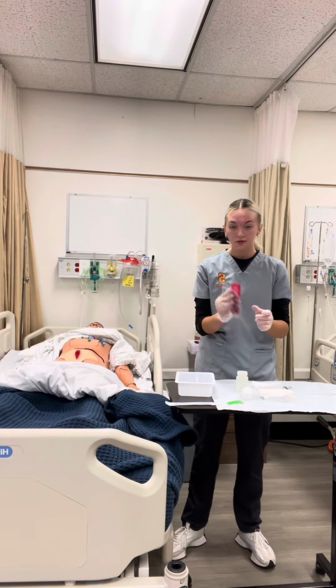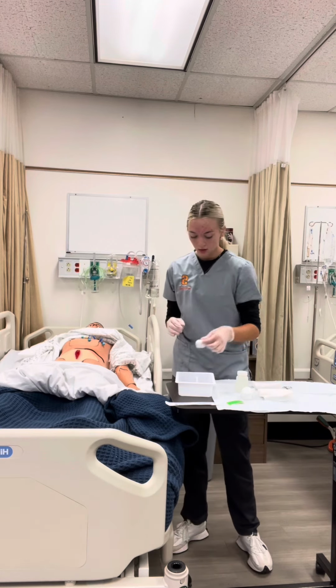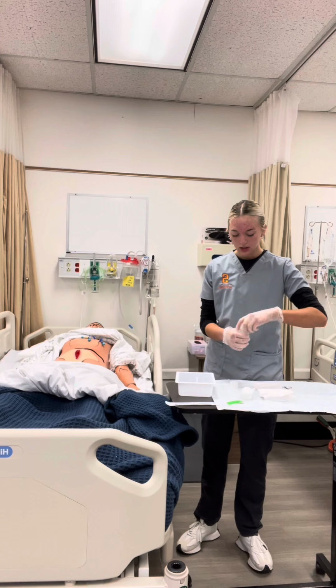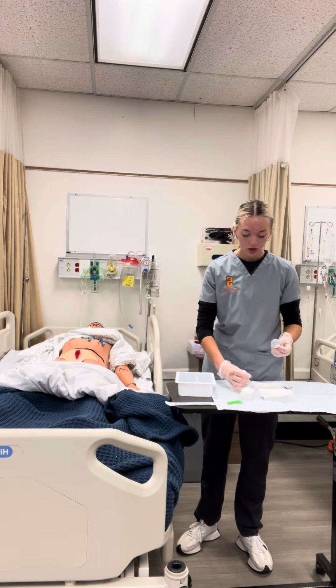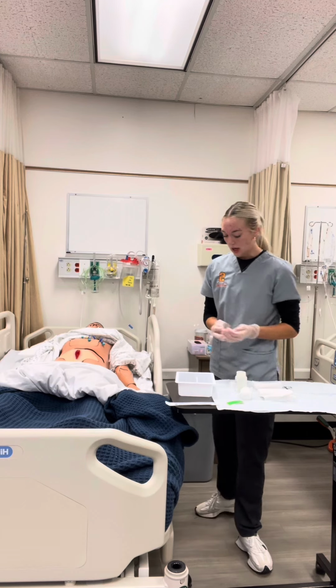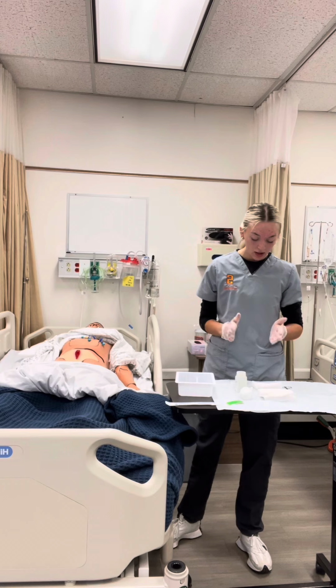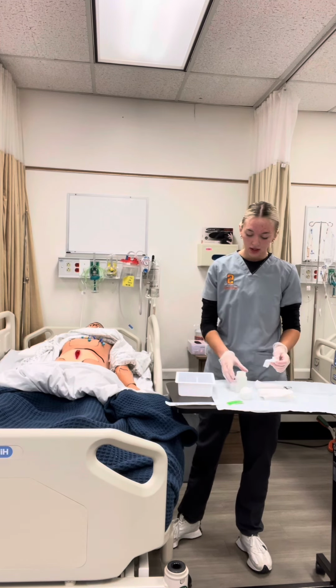I'm going to dispose of these because I won't be using them. All right. So now I'm going to begin cleaning my patient's wound with the prescribed solution. And I'm keeping my hands in front of me and in my view, as well as my sterile field.